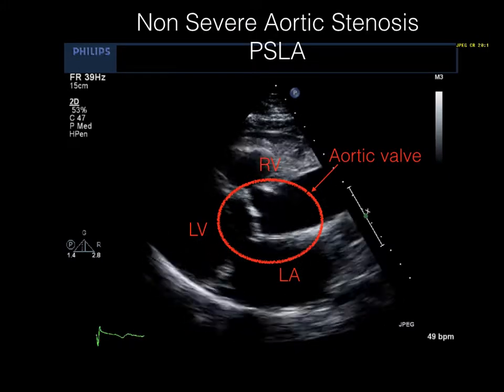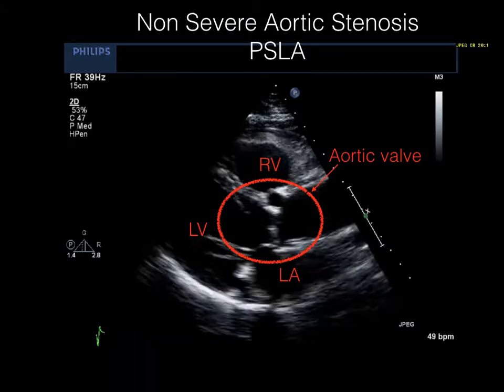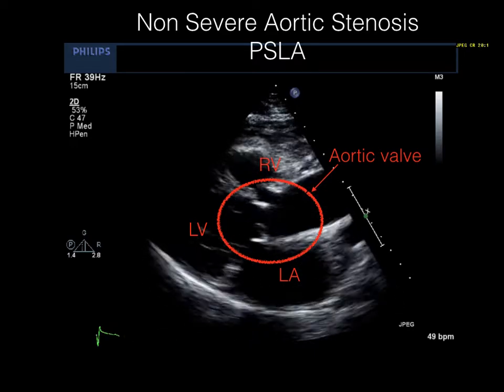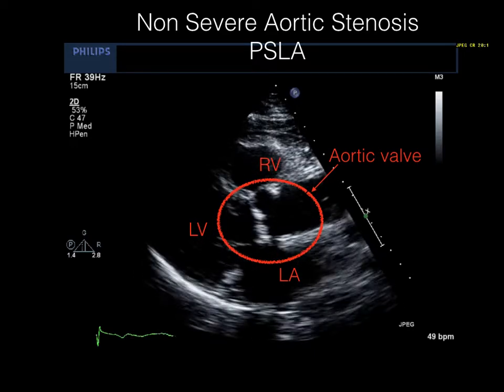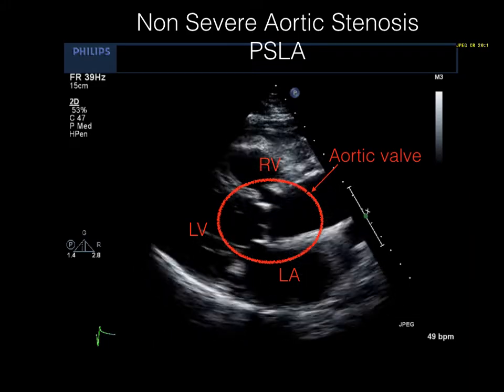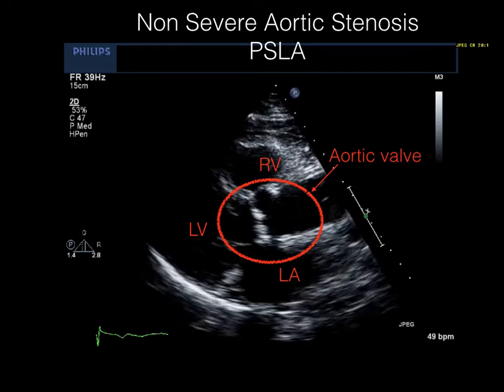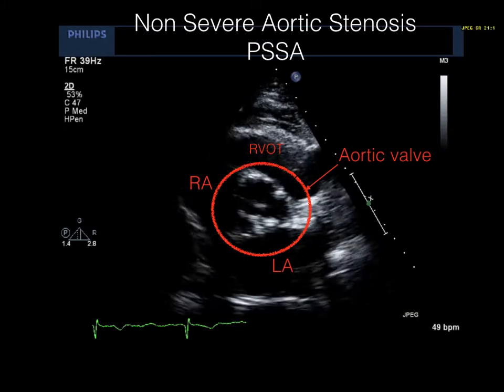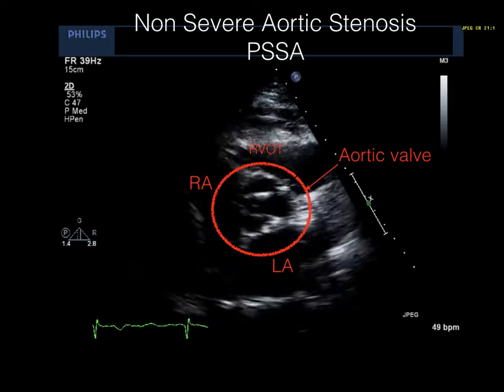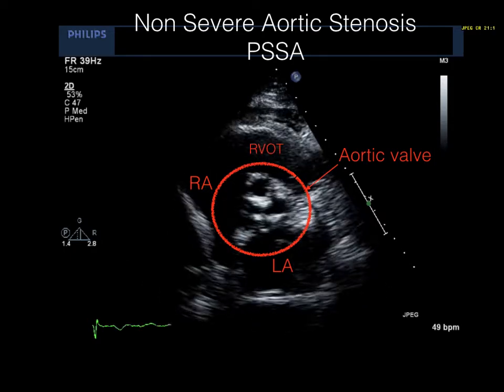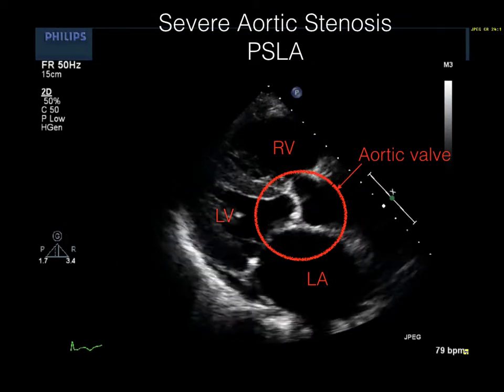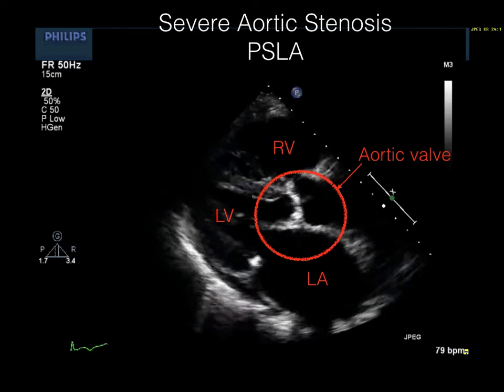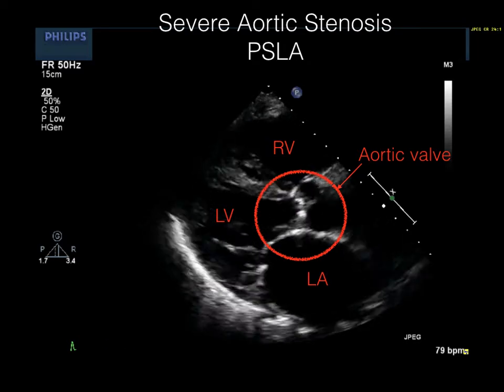Here is a parasternal long axis view of the aortic valve showing some movements of the aortic valve, excluding severe aortic valve stenosis. We can see though that the valve is thickened, looking hyperechoic compared to a normal aortic valve. In this parasternal short axis view, the cusps are moving, but we can still see that this valve is thickened. This is a parasternal long axis view showing no cusp movement of the thickened aortic valve.